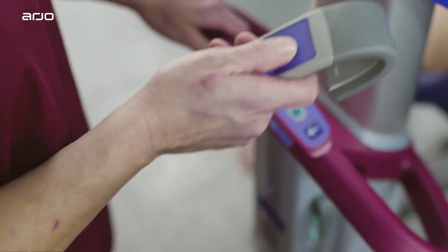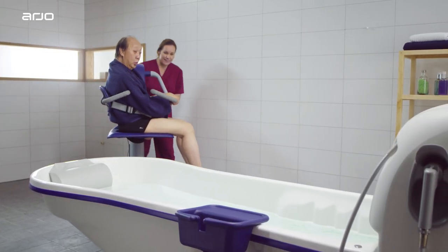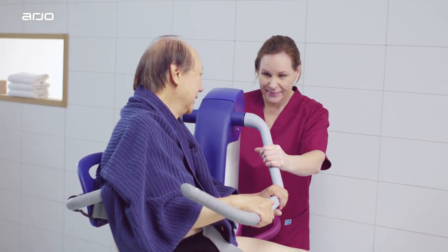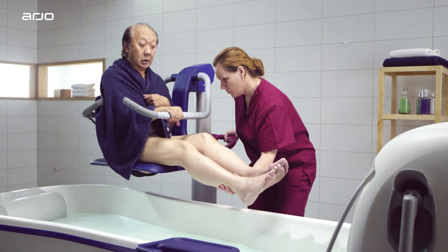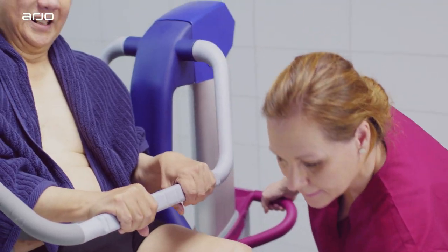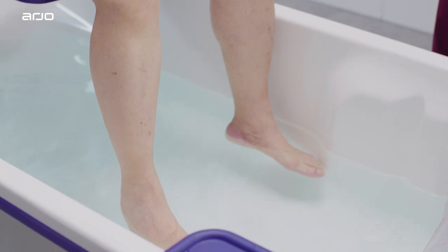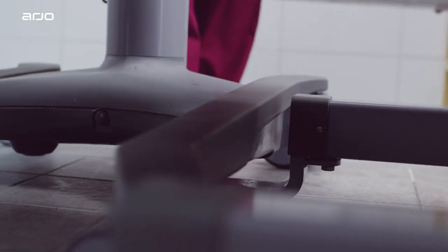Raise the Alenti up to a height where both the chair and the resident can clear the edge of the bathtub. There should always be enough space for all of the resident's body to clear the edge of the bath. Assist the resident with moving his or her legs over the bath rim as you rotate the lift in place. Let the resident feel the water and adjust the temperature if needed. Centre the chair over the bathtub until it stops against the bath.